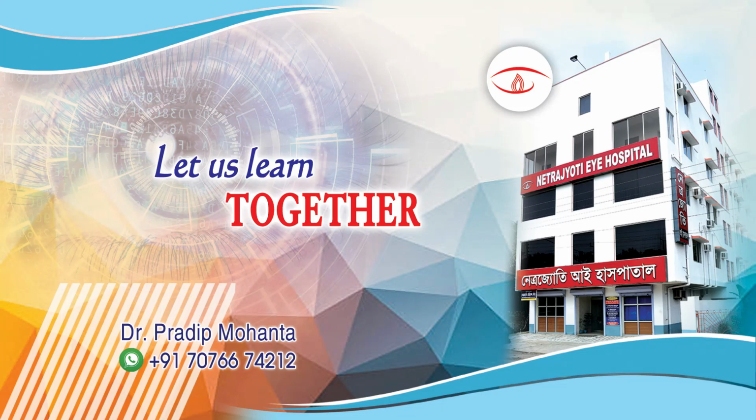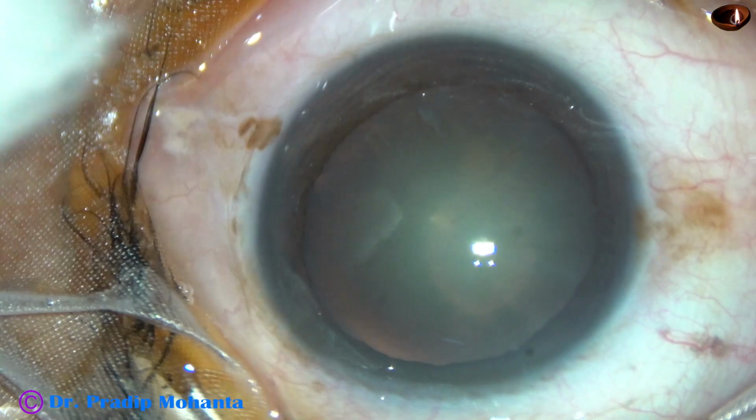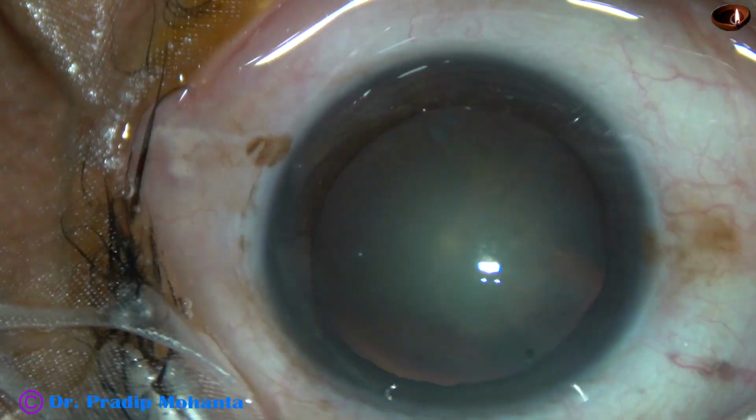Friends, welcome to my workplace at Ranaghat, West Bengal, India. This is a posterior subcapsular cataract with nuclear sclerosis of grade 2. Let us observe this surgery.